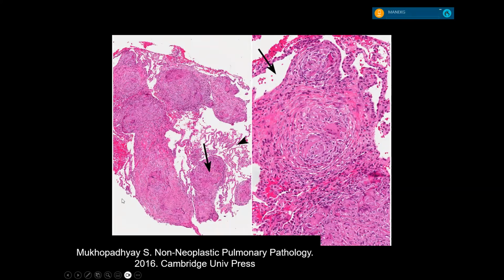Necrosis is present. It's again difficult. It's pink debris without any structure in it. There's no nuclei. It's just debris. It's like the tissue is falling apart, but not like fibrosis pink. So telling what is fibrosis and what's necrosis takes some experience. Good point. Just imagine pathology is a thing where we spend our lives telling what pink means what, or what purple means what.